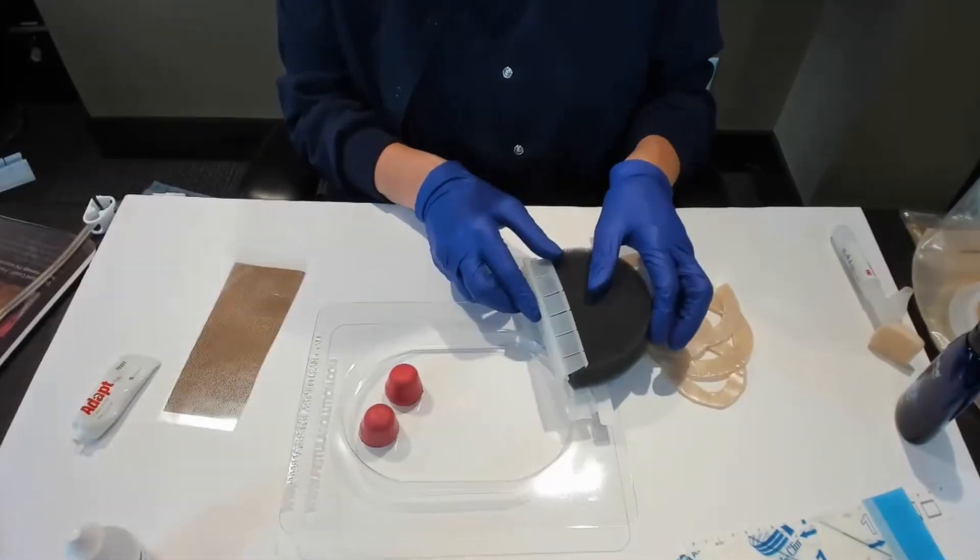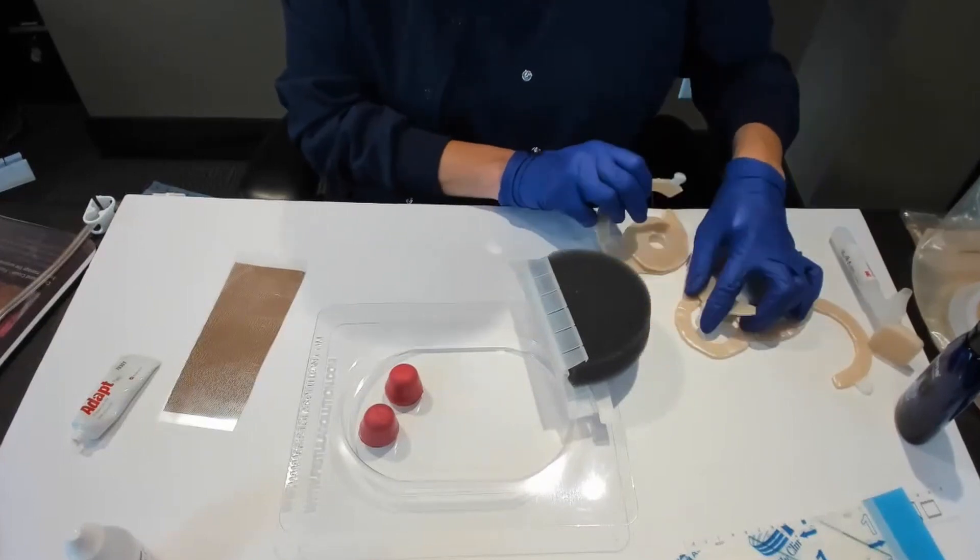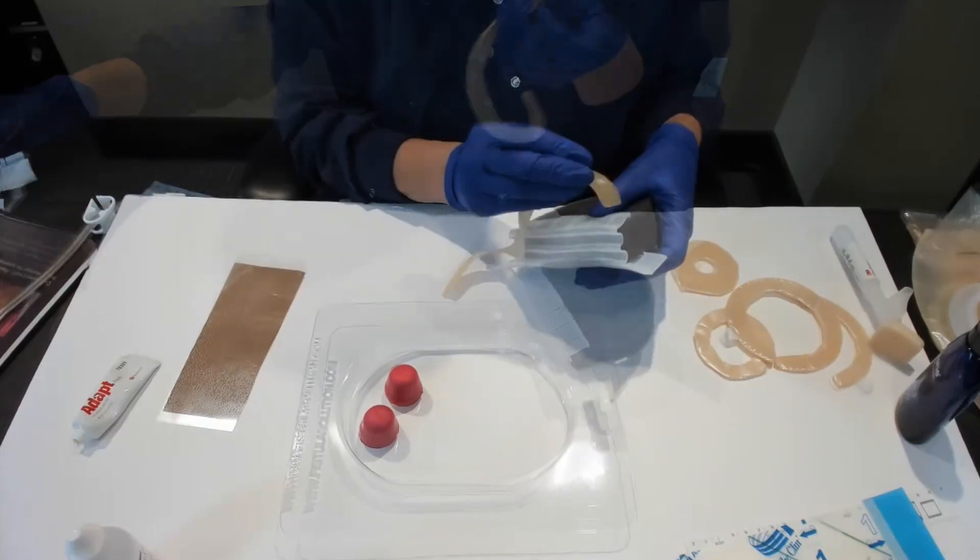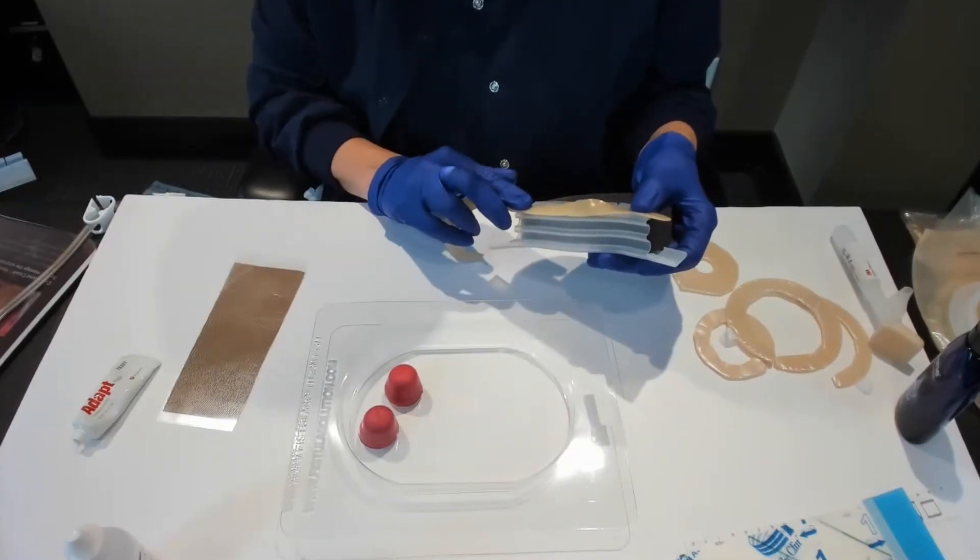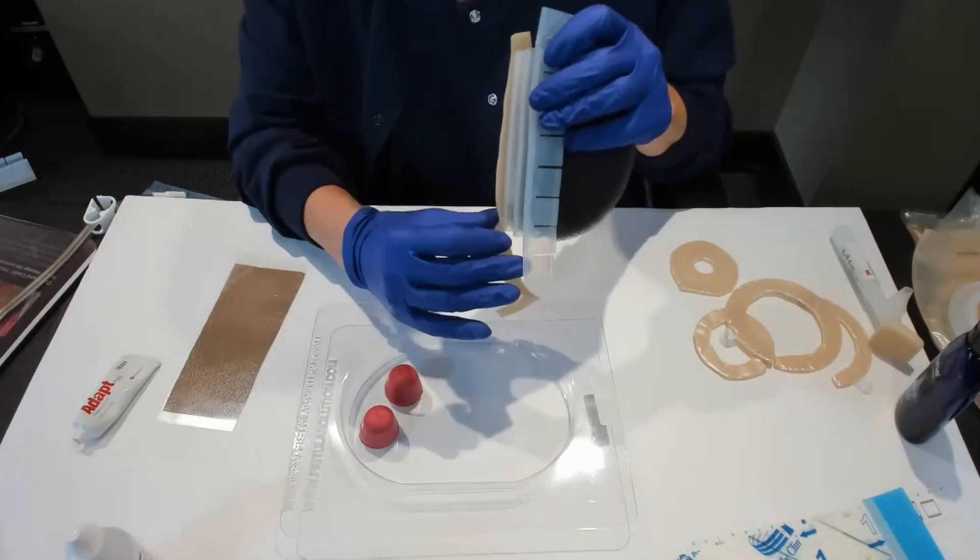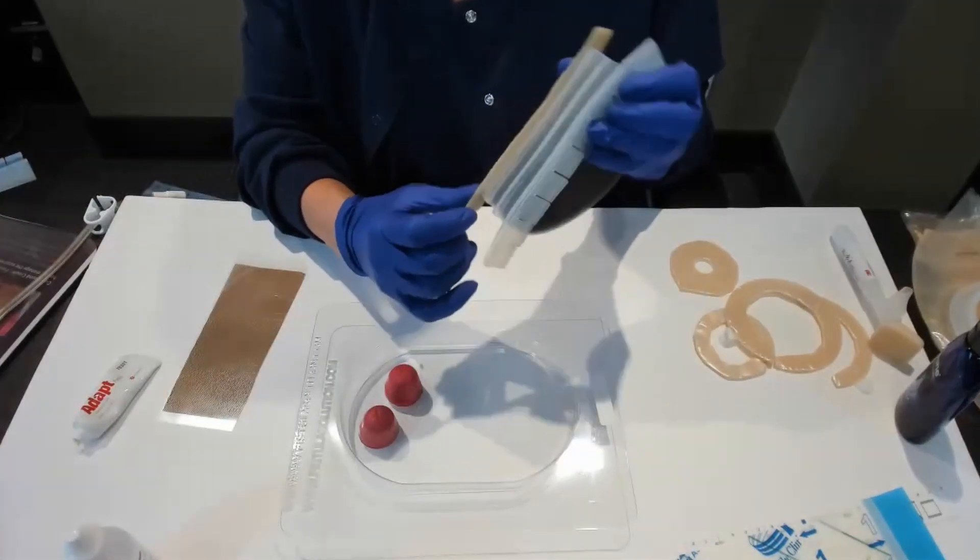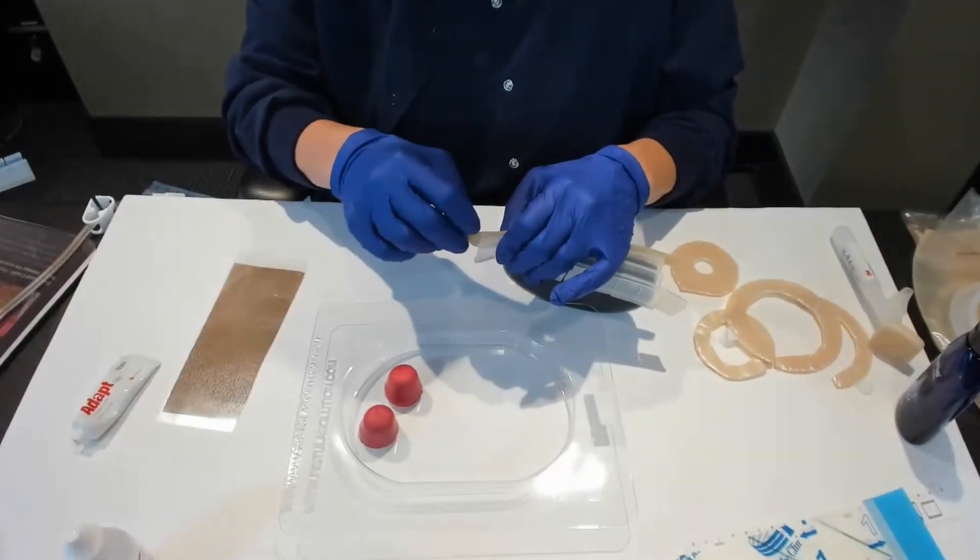On the bottom side of the isolator strip, you need to use these hydrocolloid rings to get yourself a good seal. You're going to want to put your hydrocolloid along the entire base so that it sticks out. Half on the backside, half on the wound side, and then continue that right up and onto the skin.